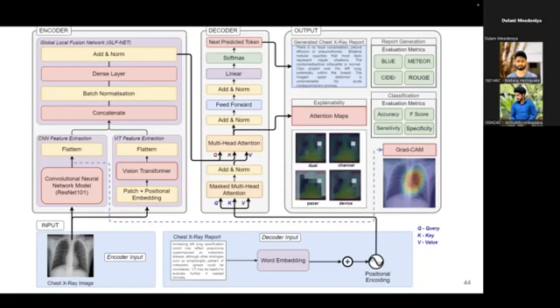On the other hand, vision transformers are designed to capture global features by leveraging the self-attention mechanism. Unlike CNNs, which process input images in a hierarchical way, ViT divides the image into small patches and processes them independently. Also, by incorporating self-attention layers, ViT models can learn global relationships between patches, enabling them to capture long-term dependencies. So using both these models together improved our model significantly.